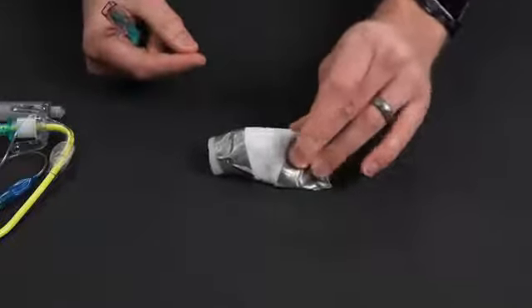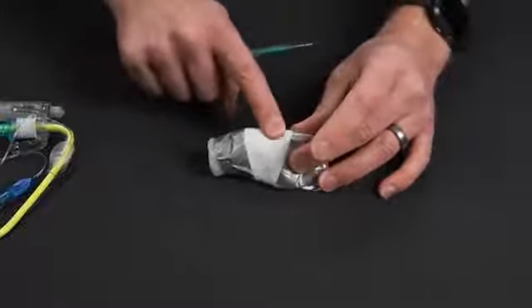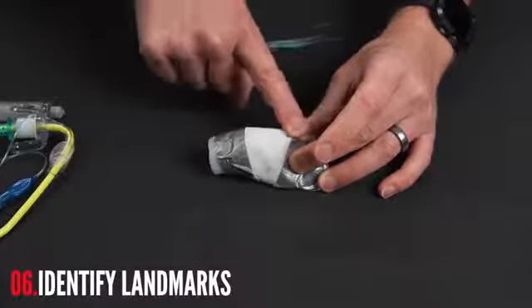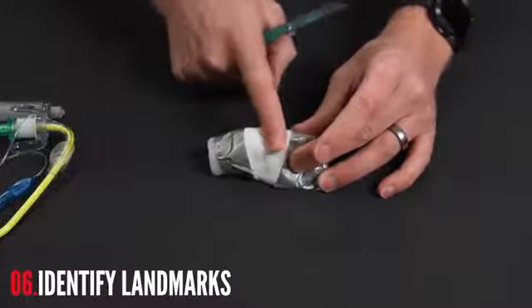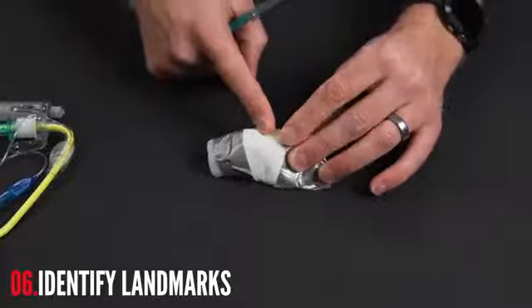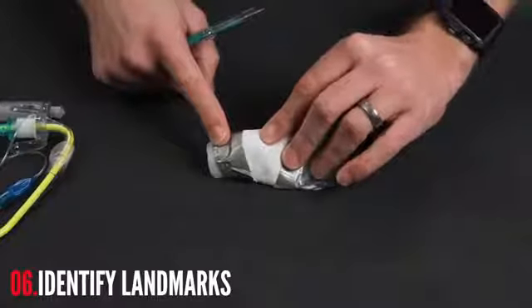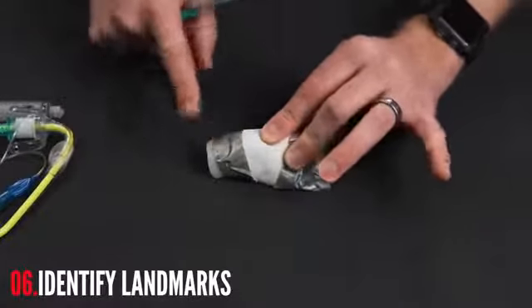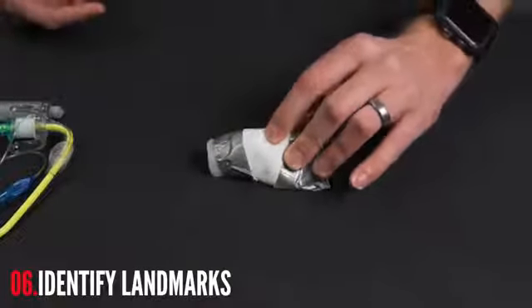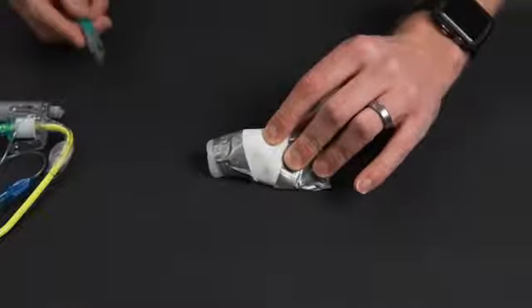So this is the first thing I'm going to do. I'm going to come up here. I can palpate my landmarks, make sure I have my prominence here, the Adam's apple, and then I come down and I can feel the actual cricothyroid membrane here, and that's where I'm going to cut. So this pointer finger here can kind of save my spot. So these two fingers are making sure nothing moves. It's just providing that pressure. This finger is confirming where I'm at.